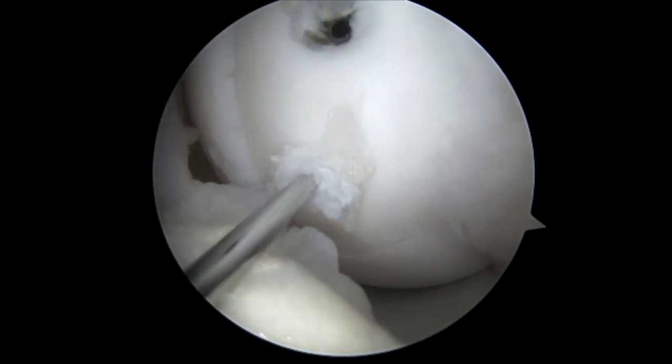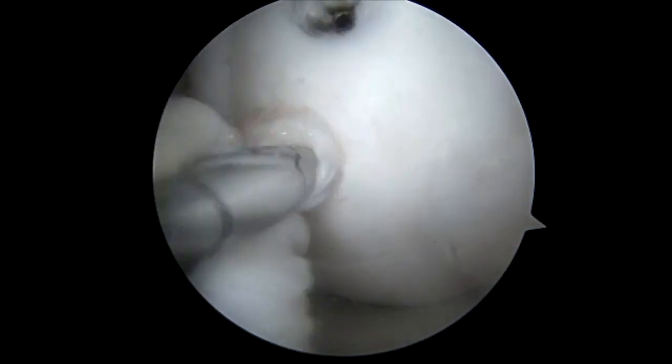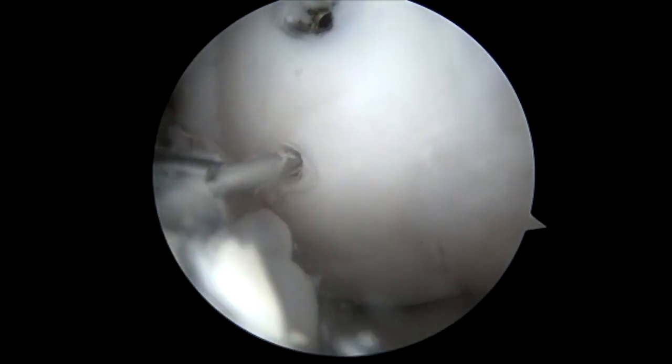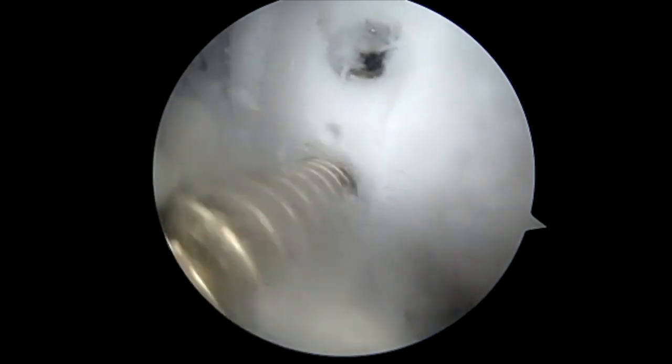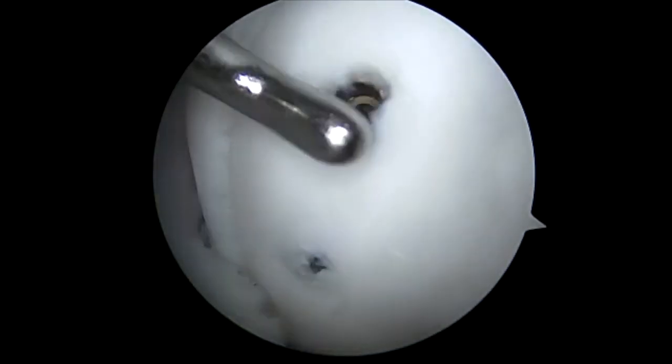After completion of the first screw, we progress again, drilling 12 millimeters into the subchondral bone, similar to our superior screw. Oscillation is performed to avoid removal of the wire. We place a 26 millimeter 2.5 headless arthrox metal compression screw. Care is taken to avoid pulling soft tissues into the wound with this method. We bury this again 2 millimeters below the surface.